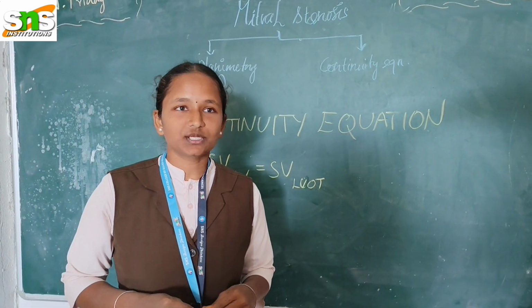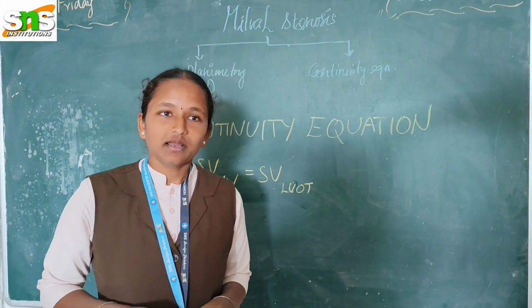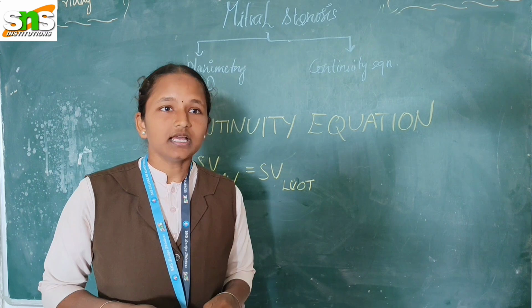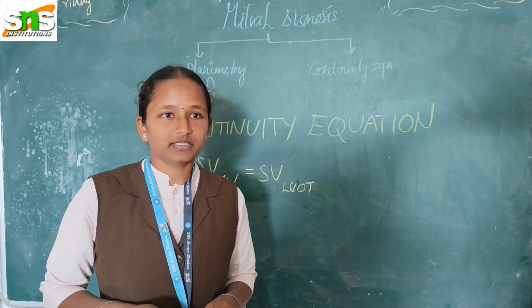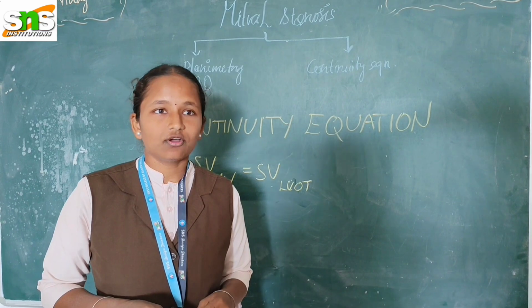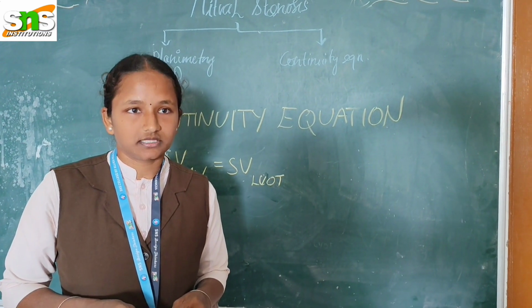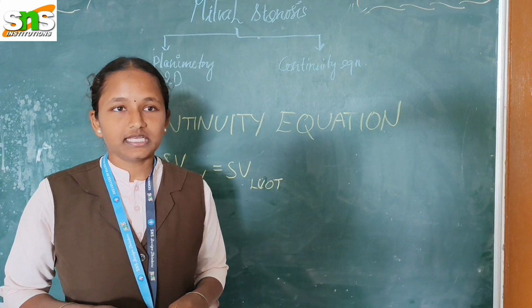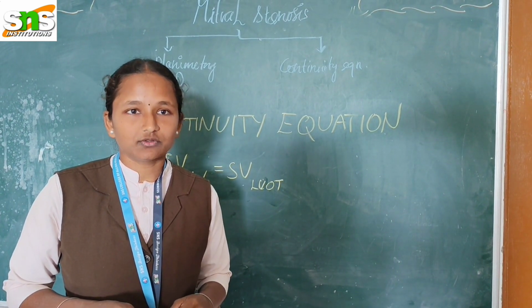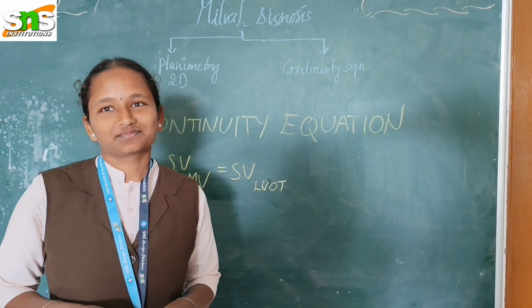The continuity equation provides a flow-based and hemodynamically independent estimate of mitral valve area and correlates well with invasive measurement. However, its accuracy depends on precise Doppler alignment and assumes the absence of significant mitral regurgitation or intracardiac shunts. In summary, the continuity equation is a valuable tool for quantifying mitral stenosis, specifically when conventional methods are limited.